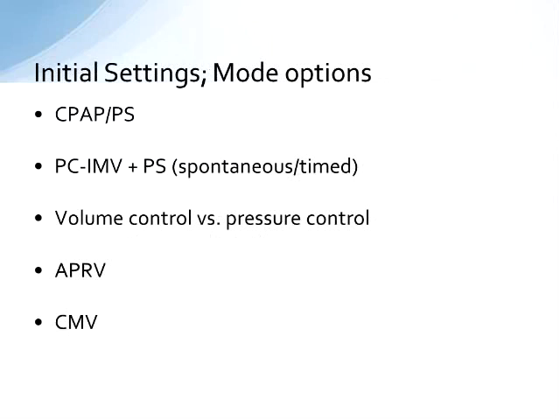As I said, there was very little data on mask and interface selection, not just in kids, but in everyone. I would say the same is largely true regarding mode and setting selections, particularly in pediatric patients. Again, this has not been well studied by any means. But generally, you can almost use any mode you want to provide non-invasive ventilation, particularly if you're using your critical care ventilator.